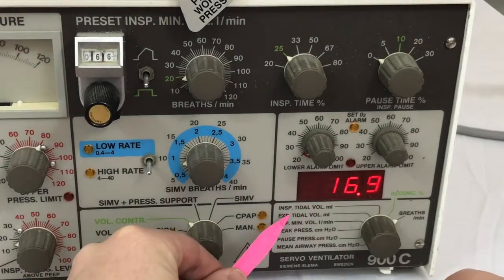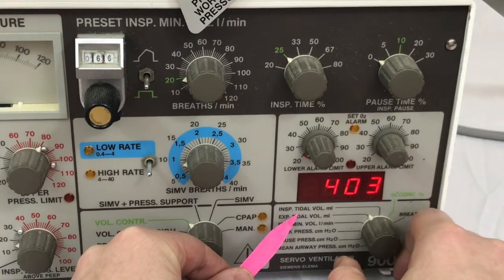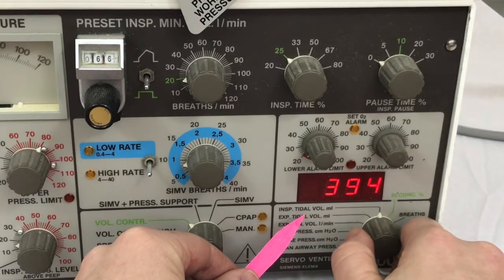And now let's go ahead and review the measured tidal volume. And as you can see, now my tidal volume is set correctly at approximately 400 milliliters where I wanted it to be.